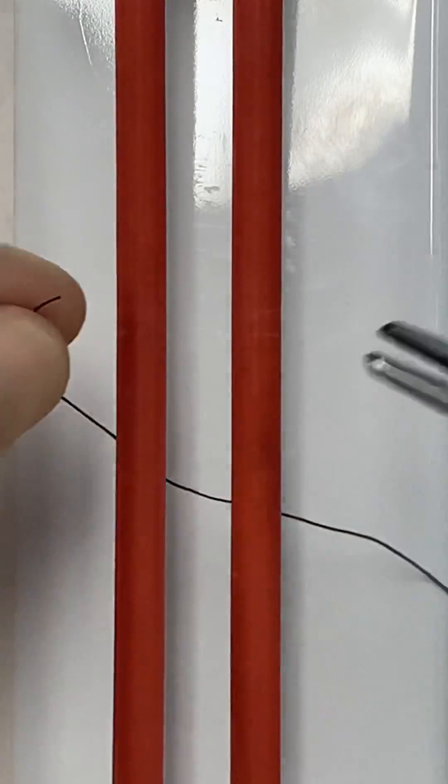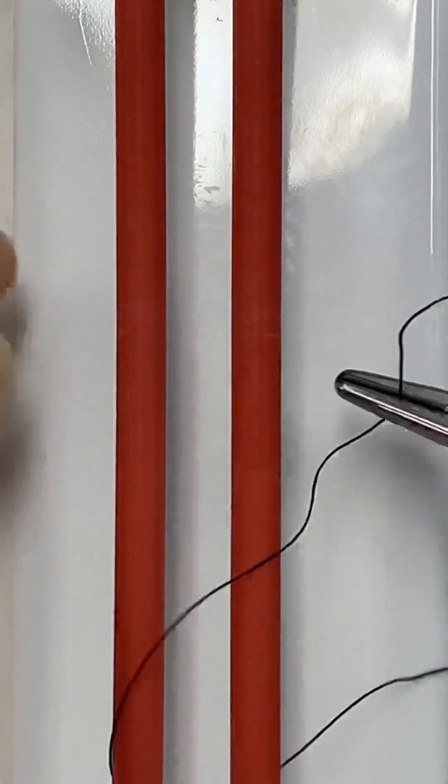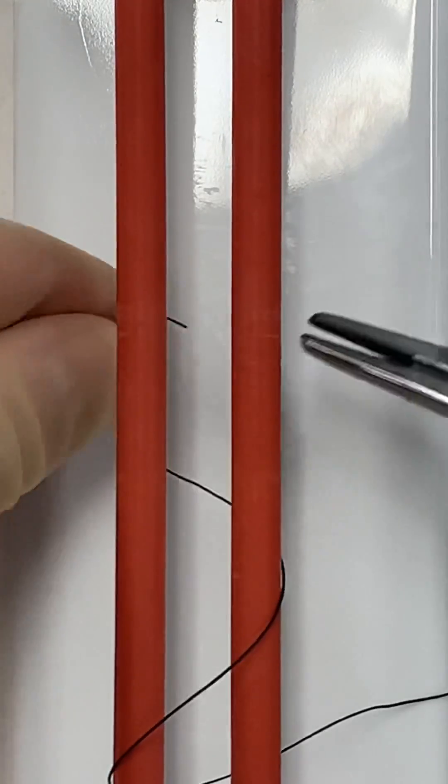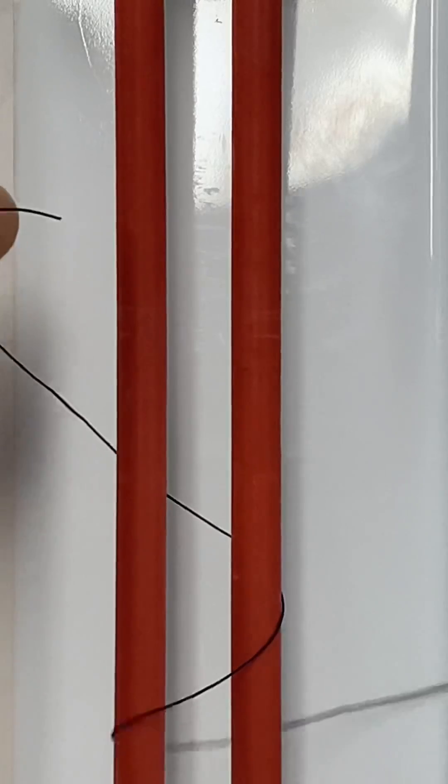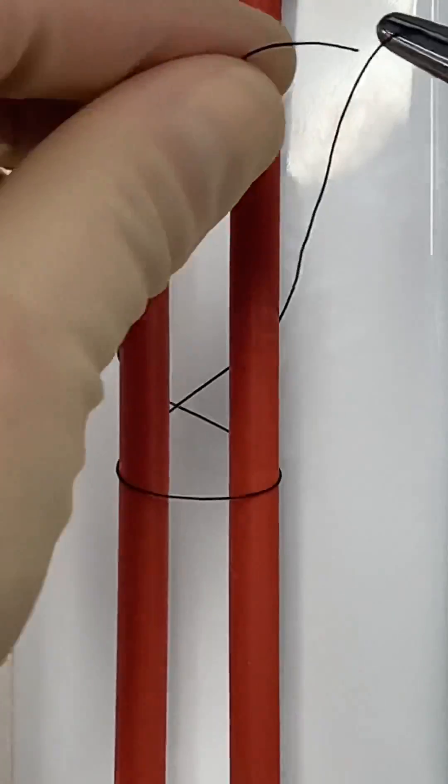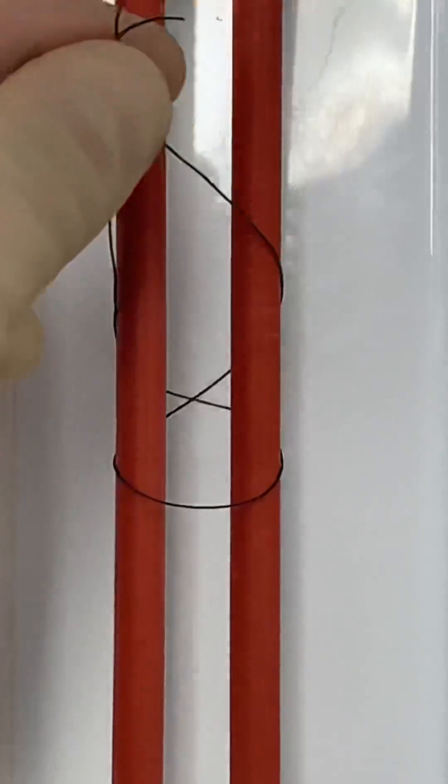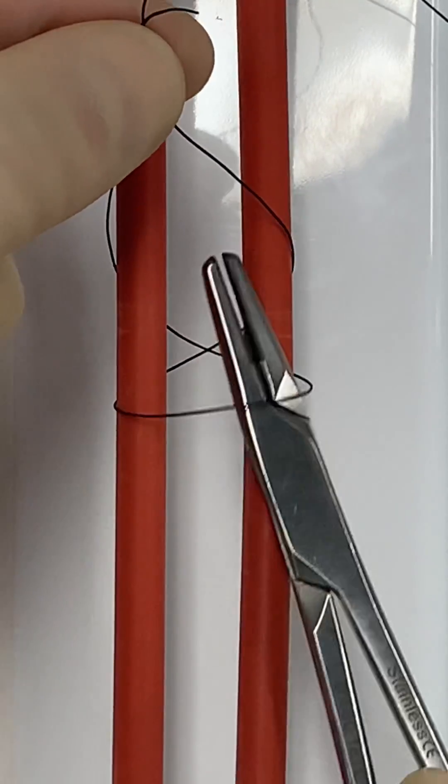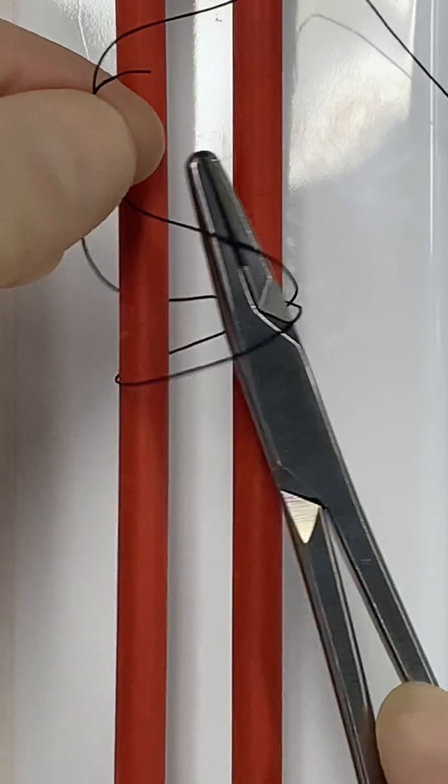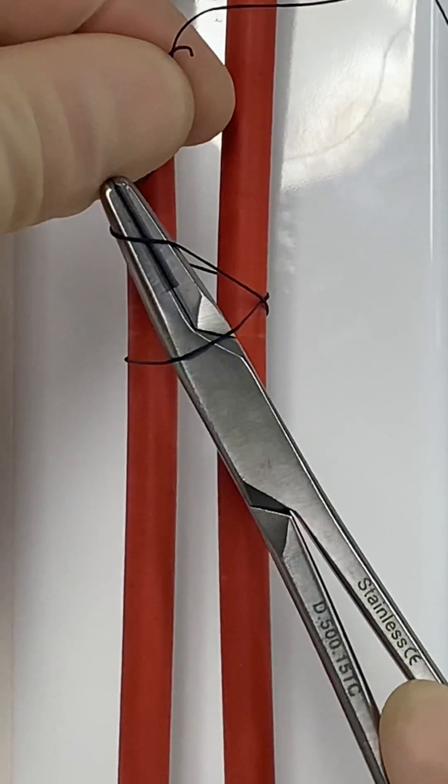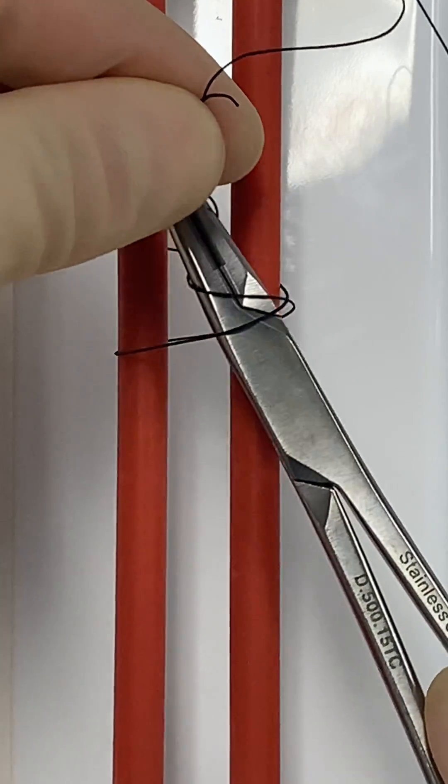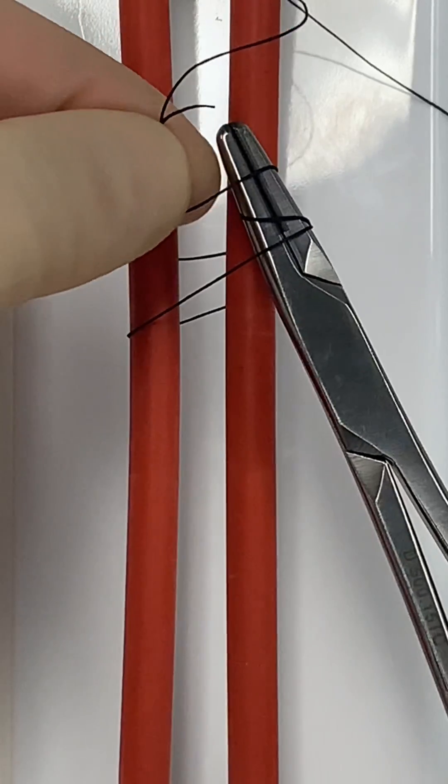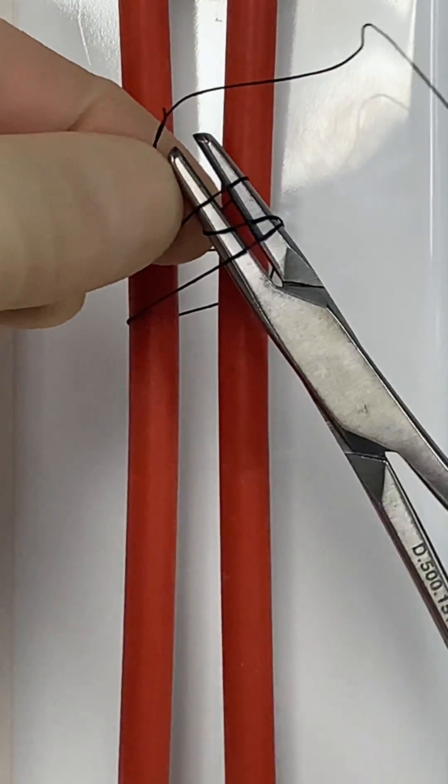It's created by passing a length of suture material around clamped blood vessels twice to create two overlapping loops. The needle driver is then passed through the first loop, and a double throw of the long end of suture material is made around its tip in a counterclockwise direction.